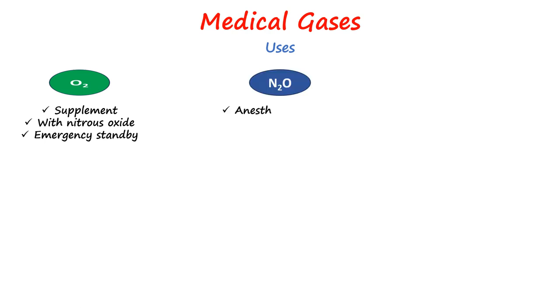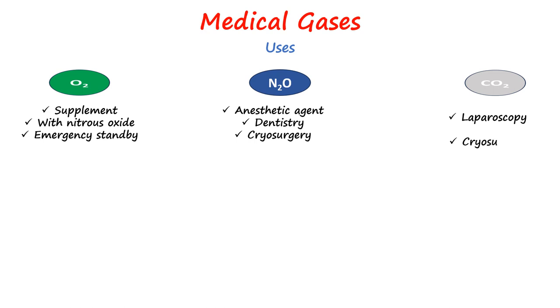Oxygen is used to provide supplemental oxygen for a variety of illnesses and procedures, with nitrous oxide in dentistry and as emergency standby. Nitrous oxide is used as an anesthetic agent in surgery, for pain relief in dentistry, and in cryosurgery. Carbon dioxide is used for laparoscopic surgeries for abdominal insufflation and as a cryotherapy agent.